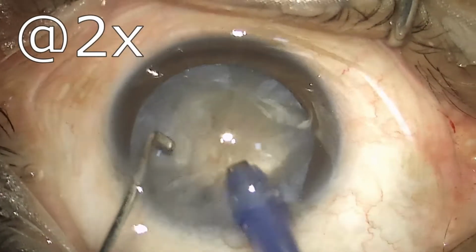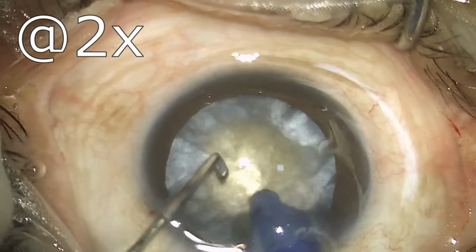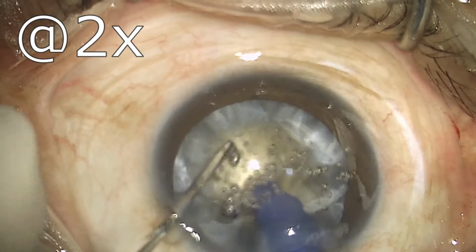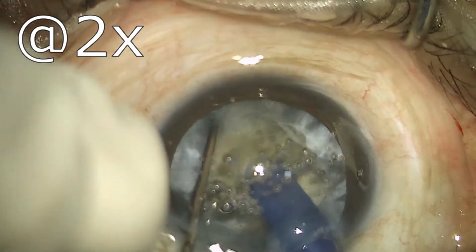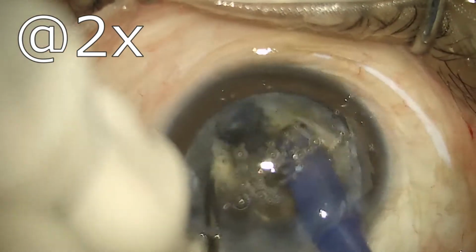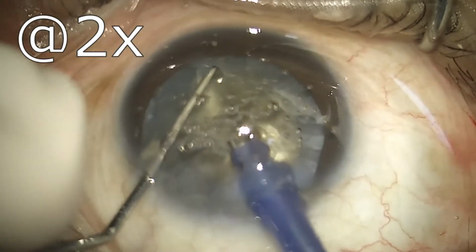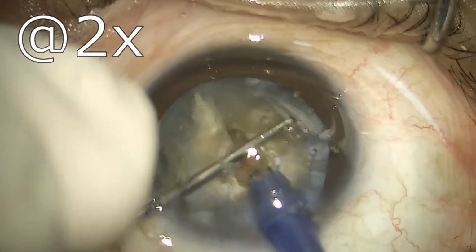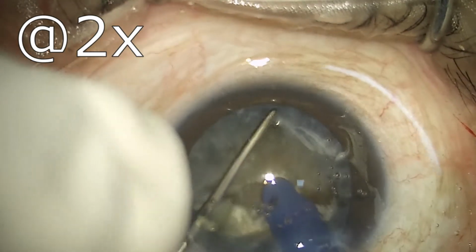This is the portion where we are disassembling the nucleus. It's a hard nucleus and a bulky one. I use a burst mode for these situations so as to get the maximum possible purchase with one or two bursts, and then apply my horizontal chopper at the equator of the lens to compress it again so as to get a good purchase.